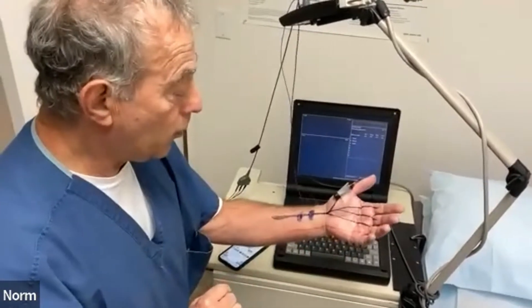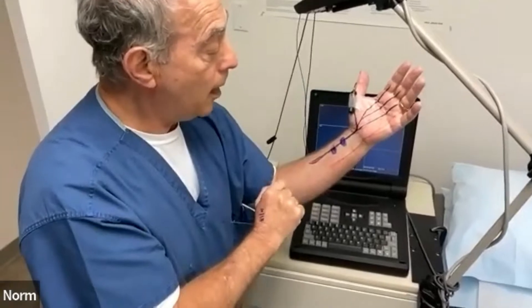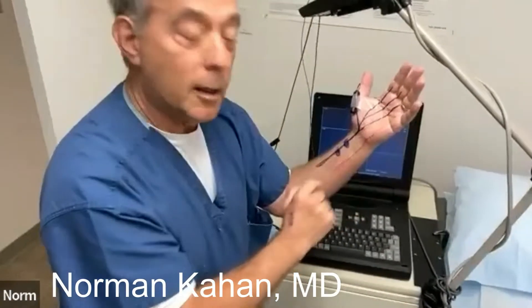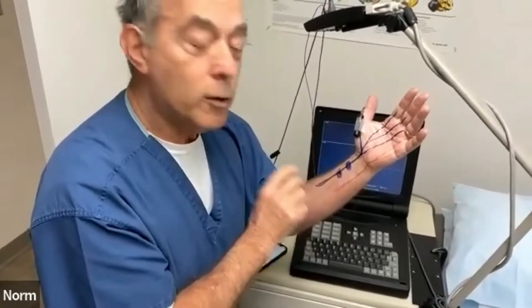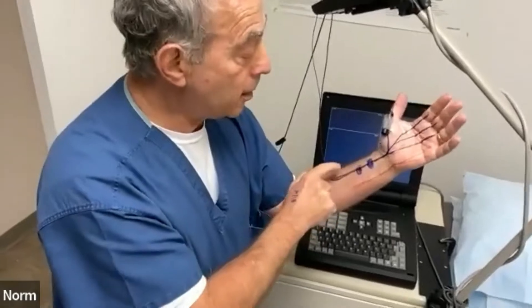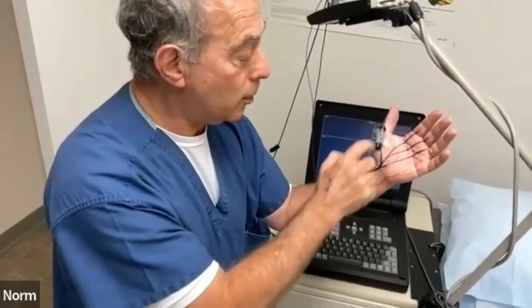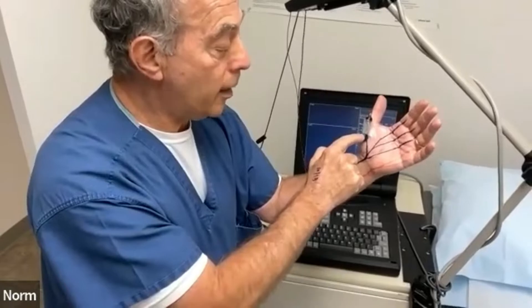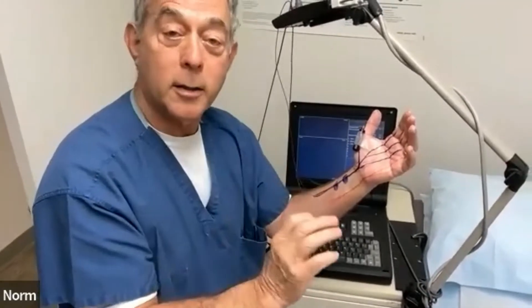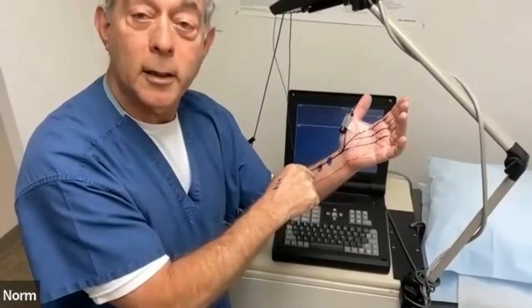We have our electrode set up here. I've outlined the median nerve in blue or purple, and then red is the ulnar nerve. I'm not going to study the ulnar nerve today, but when you do a nerve test, you're stimulating the nerve at a point eight centimeters proximal to the reference. This is going to be my reference or recording site, which I've placed right over the abductor pollicis brevis muscle — the terminal muscle on the median nerve.